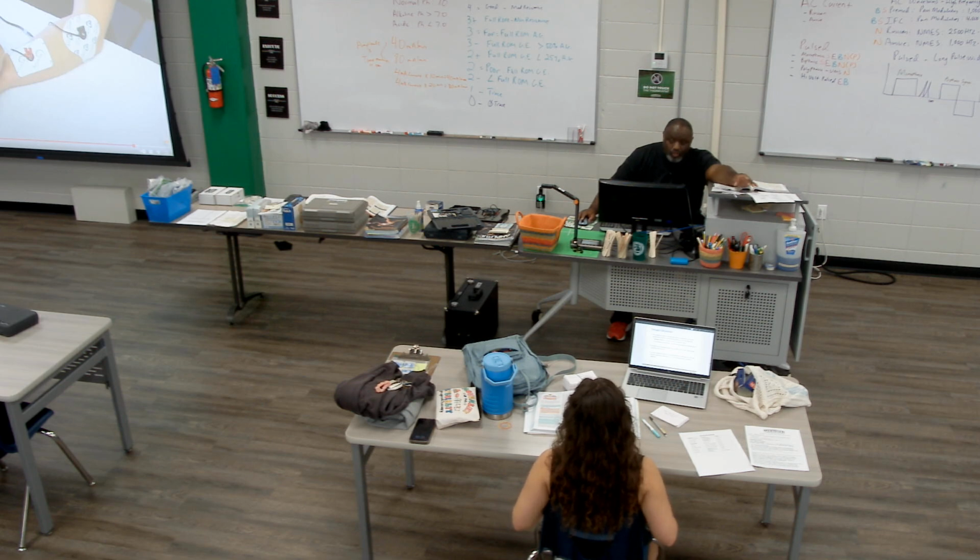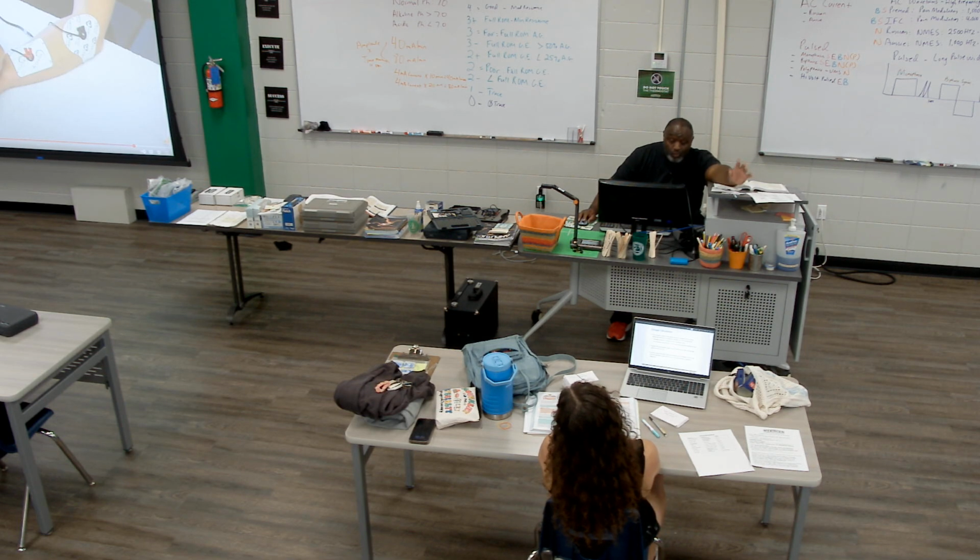But the actual time the patient is there is going to be based on how many milliamps of current they can tolerate. And again, DC is really uncomfortable if it gets really high. So it starts to bite, it starts to become really uncomfortable. So a lot of patients really would prefer lower current milliamps than the larger ones. And assess the condition of the skin.